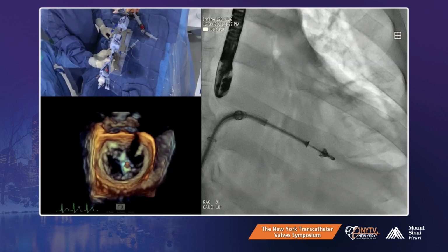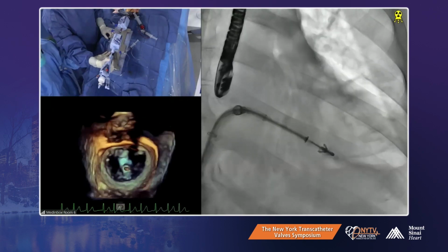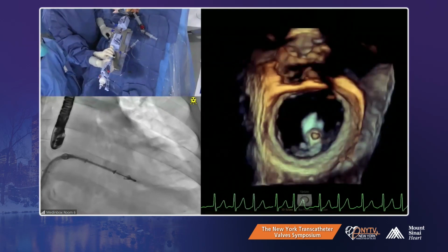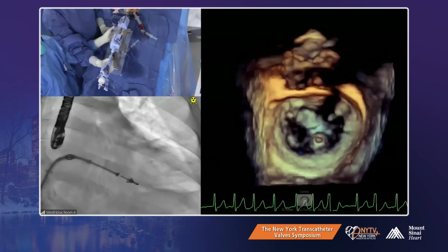You put it in. Bring the alpha and increase the gain. The orientation's off, and it needs a little bit more clockwise. You're still off a little bit. I think you need to clock another half hour. The 3D helps a lot.